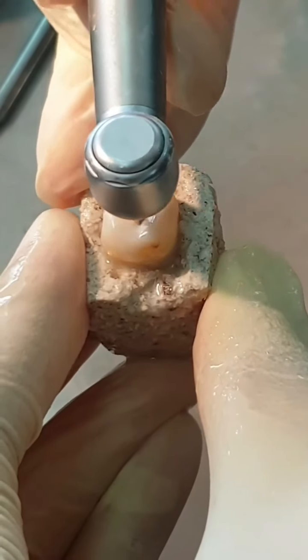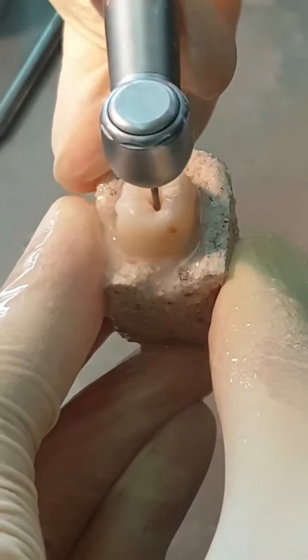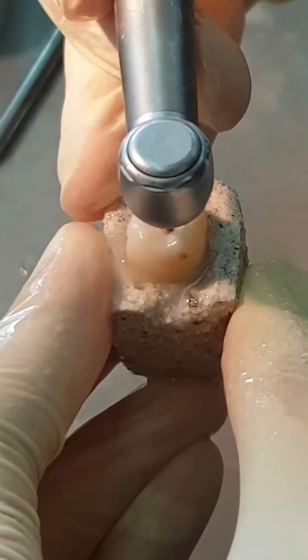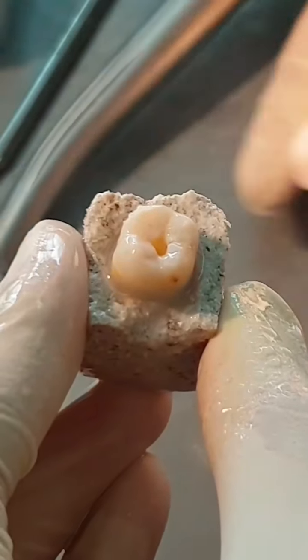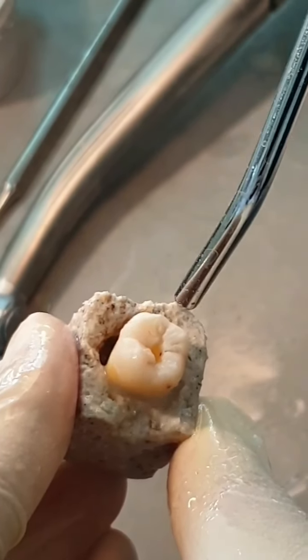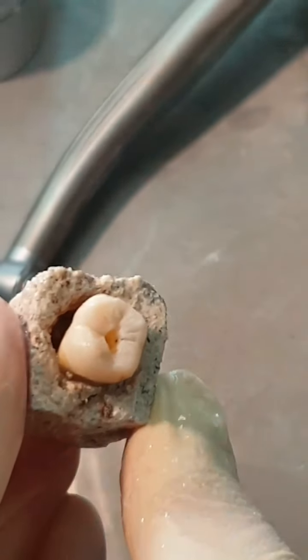As you see, we use the walls of the burr in this stage, and the tip of the burr is not active anymore because we are in the pulp chamber area. We do this because we want to reduce the risk of perforation and we want to be as conservative as possible.